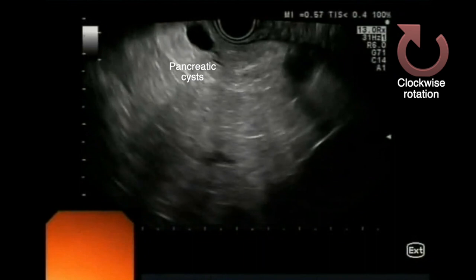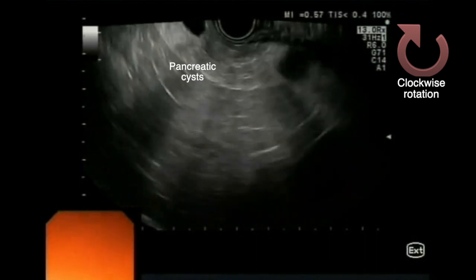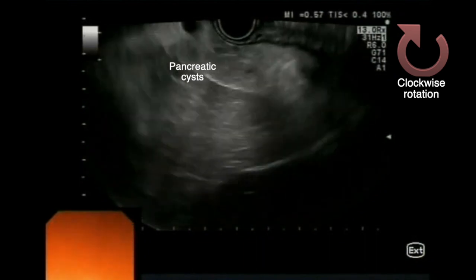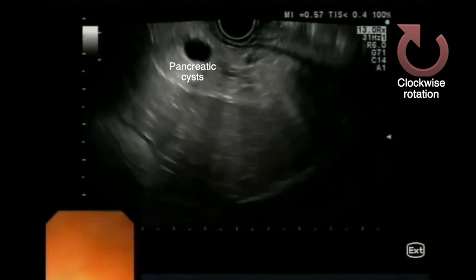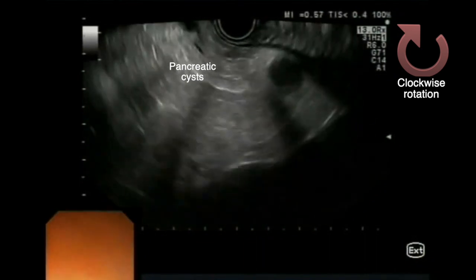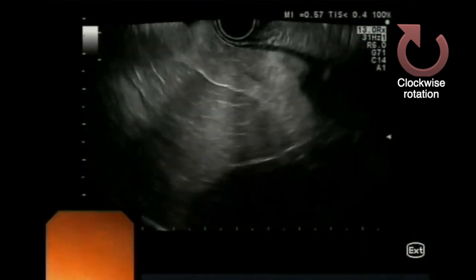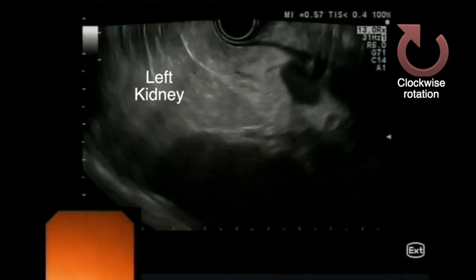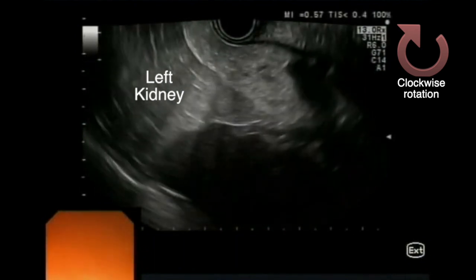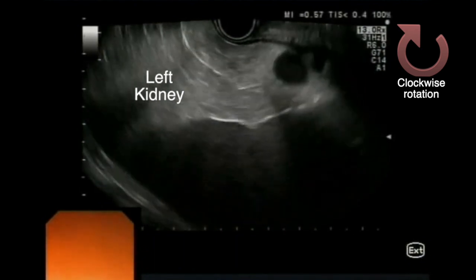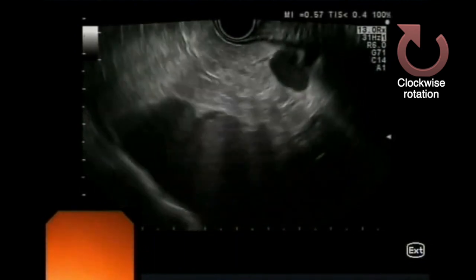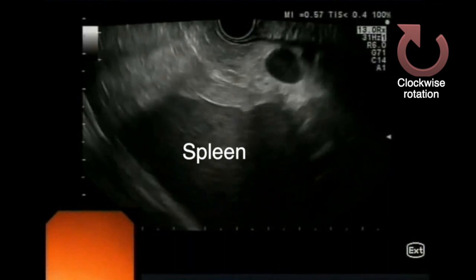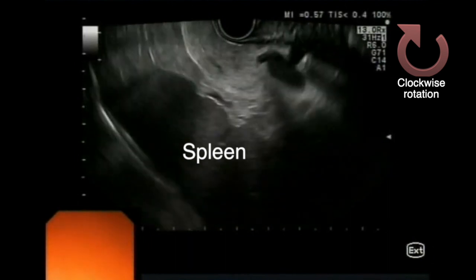On the left side of the screen, below the pancreas, the left kidney is the landmark of the passage between the body and tail. Pushing the up-down wheel, the tail of the pancreas can be followed to the hilum of the spleen on the right side of the screen.